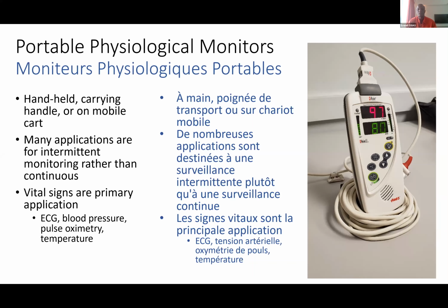And this is one of the things that Haiti Biomedical Solutions is working on now. We are trying to see if we can get a training established in the next 5 or 6 weeks. It's going to be based on oxygen therapy, because we understand with the patient monitors that the SpO2 thing is very important, but it's related to the oxygen.